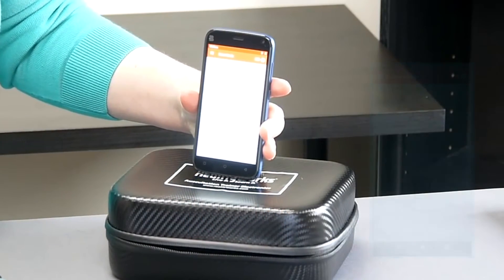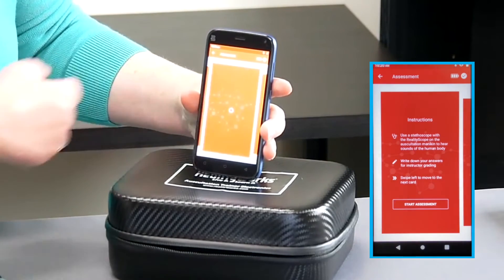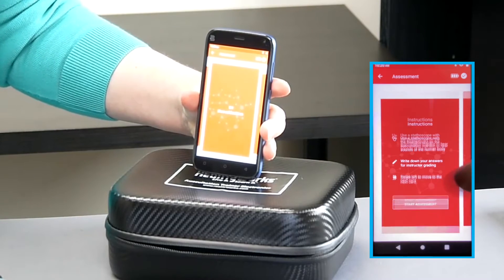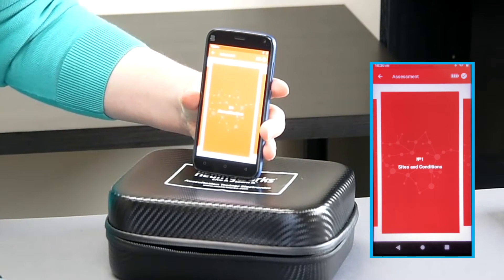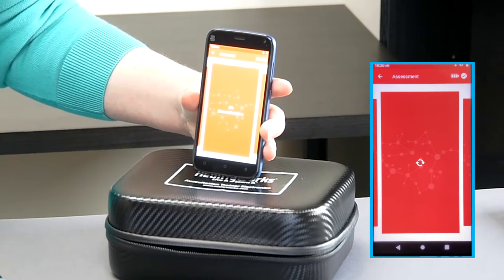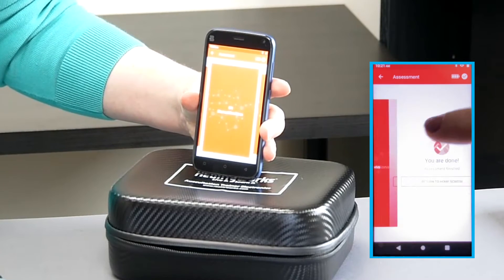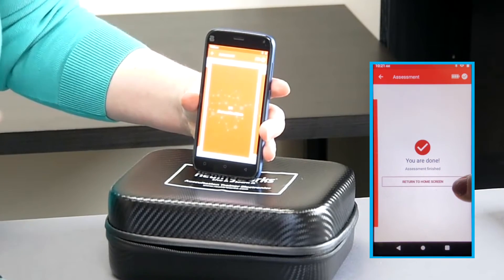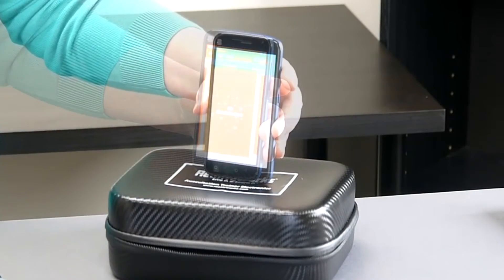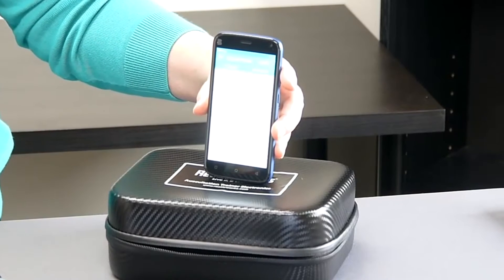Let's talk about assessment mode. You can choose to assess with the skin overlay on the torso or you can remove it. Students are presented with a card on the tablet screen — they must listen to the torso, identify the sounds they're hearing, and record them on a piece of paper or however you wish. Then they swipe to the right to move on to the next card.